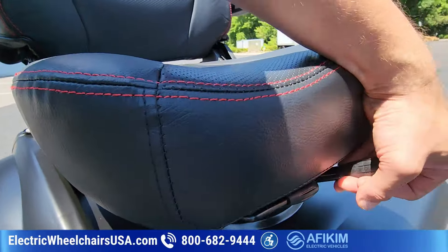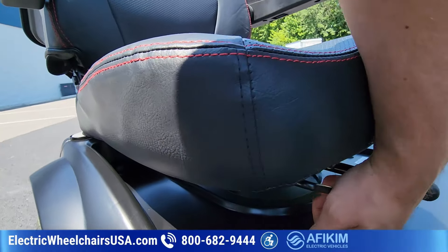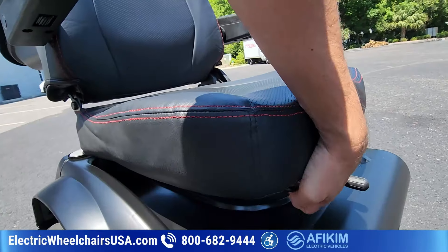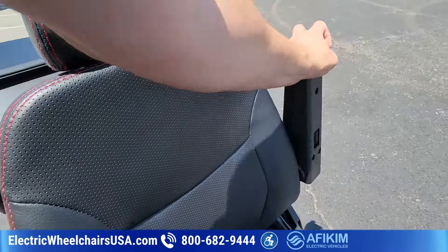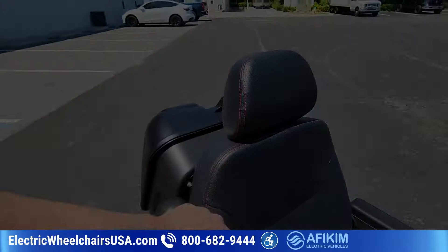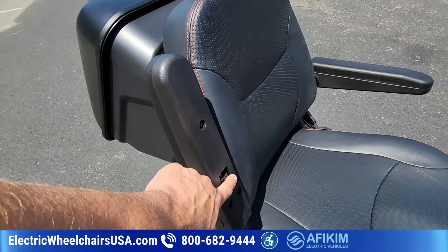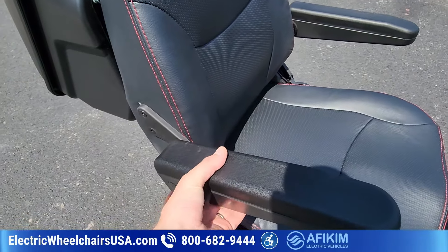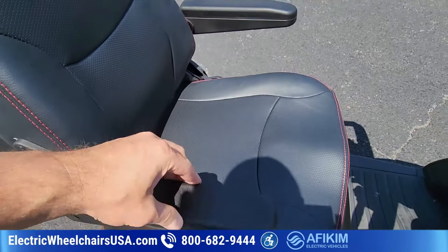To swivel the seat, you press up and then swivel it. This lever slides the seat forward and backwards. The armrests also flip up, the headrest is adjustable, and the angle of the armrests is adjustable too — you move this dial and it adjusts the angle. It's a minor thing, but some people like that. There's also padding on these armrests.